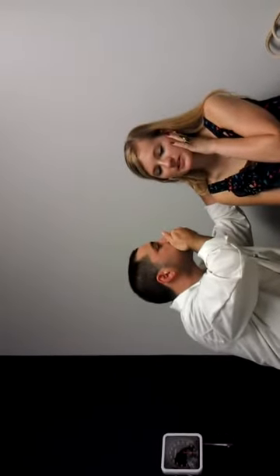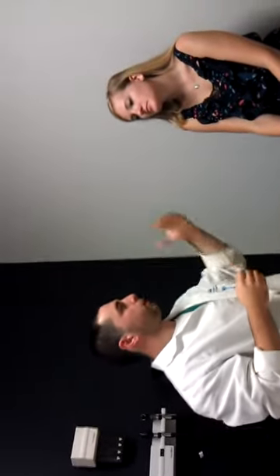Liberty Nursing. Liberty Nursing. Brian Buchanan. Brian Buchanan. Allison. Allison. Purple Shorts. Purple Shorts. This is bilaterally assessed. The passing rate is 50%, so the patient is well over and exceeding the passing rate. The right ear is intact, and I will go ahead and do the left.